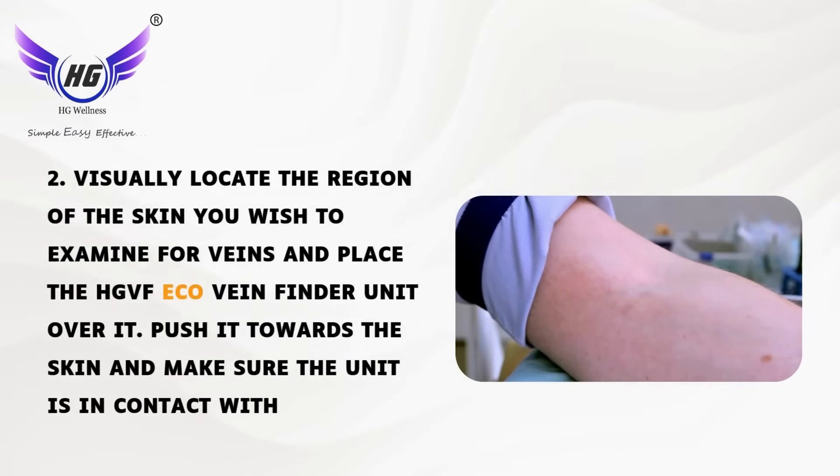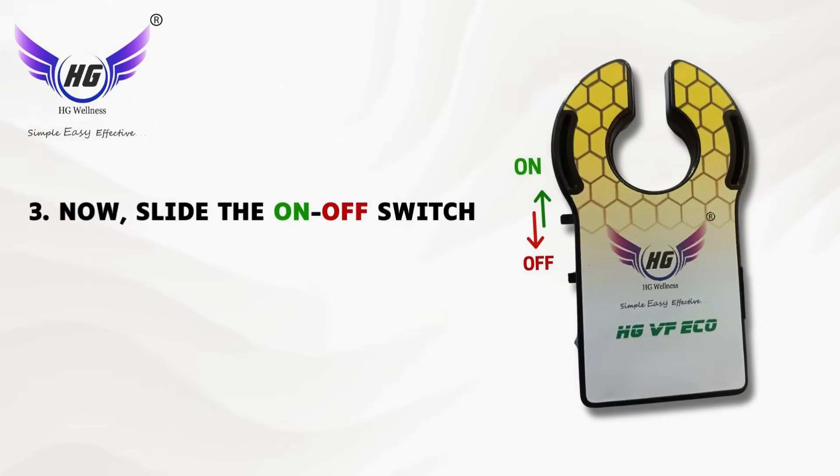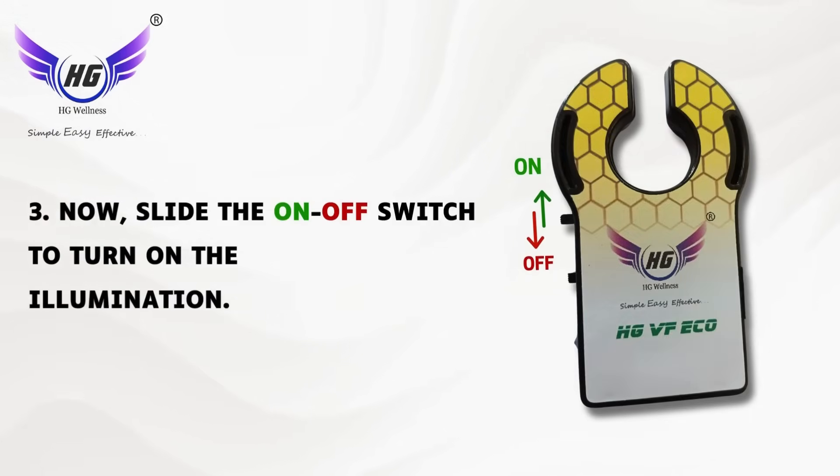Push it towards the skin and make sure the unit is in contact with the skin. Third, slide the on/off switch to turn on the illumination.